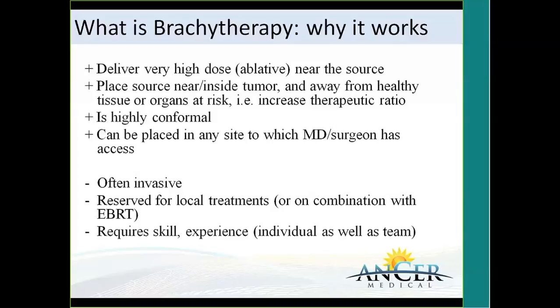So where can it be used? It can really be used anywhere the physician or the surgeon has access to. You can stick a needle or an applicator or catheters in an orifice, or you can do it intraoperatively. The reason it is not used more commonly is because it is invasive. Many times it may require anesthesia or surgery, and it is also very localized. And so in cases where you need to treat other tissue, lymph nodes, or the whole torso or the whole pelvis, this type of radiation is not necessarily suitable.